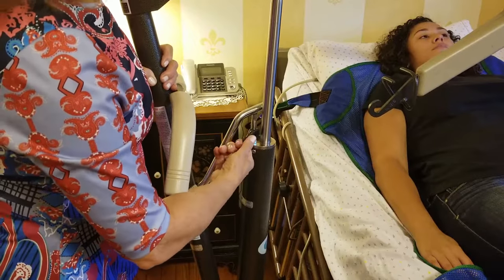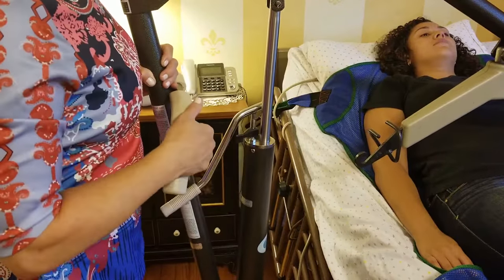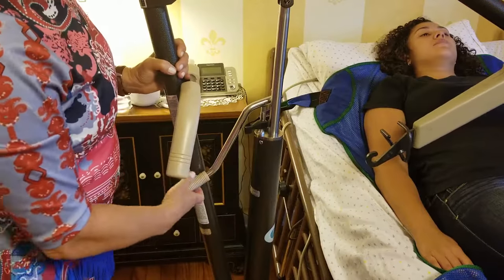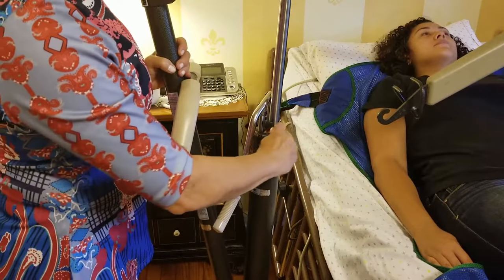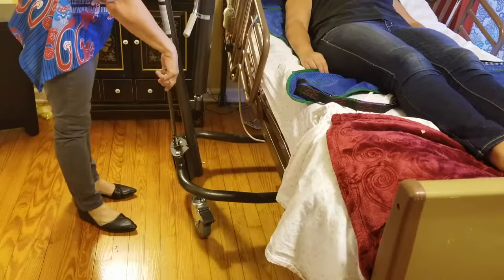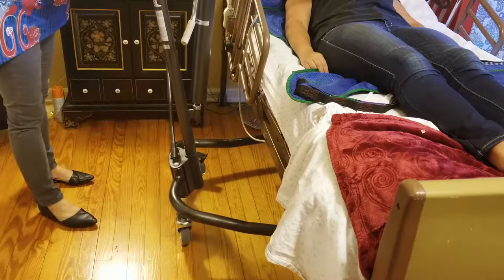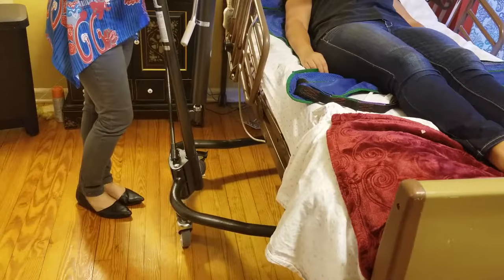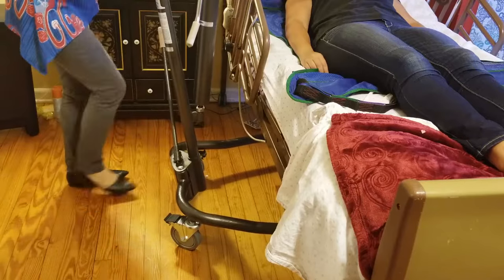There's a small black lever on the lift. If you turn it counterclockwise, it lowers the top part of the Hoyer apparatus. Turning it clockwise locks it — anytime you feel unsafe, pull it close to stop the device from going down. There's also a cranking lever that raises the sling off the bed, and pushing the knob lowers it again. A separate crank at the bottom opens the legs — make a full semicircle and the legs spread out under the bed for stability. There are also locks on the wheels so the lift stays secure while you get the patient ready.